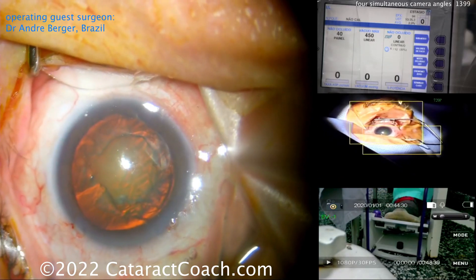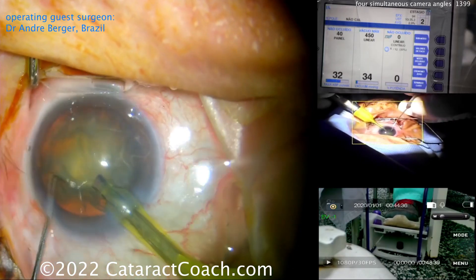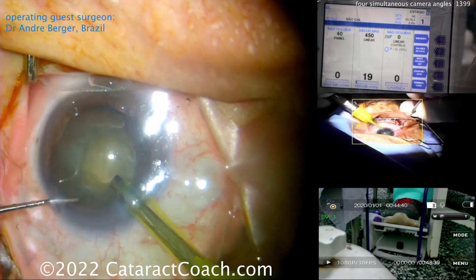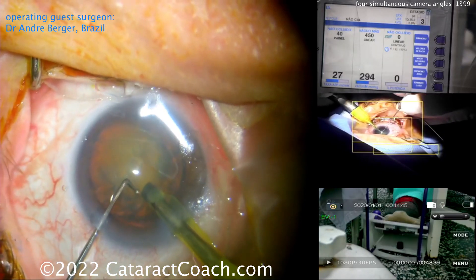Now he's positioning his foot on the foot pedal, getting comfortable. Chopper going to lift the incision — probe inside the eye — and he's going to start off by removing some anterior lens material and then really rotating that nucleus around. Look at that rotation — Brazilian style! I love it, fantastic.